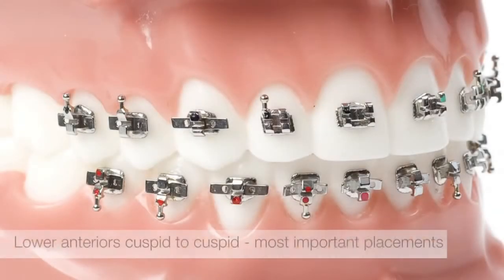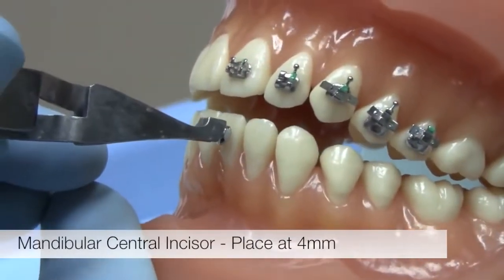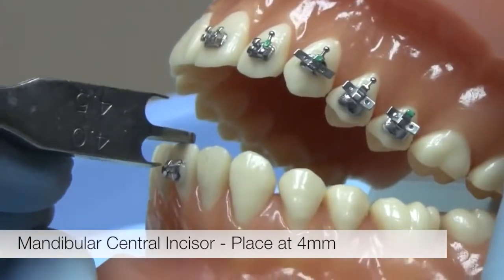From here, we move to the most important bracket placements, which are the lower anteriors from cuspid to cuspid. By placing these brackets accurately and with the proper angulation, we can properly spread apart the roots of these teeth. Start with the central incisor, which is a single bracket with wings. Place it at the center of the tooth with a height of 4 millimeters.